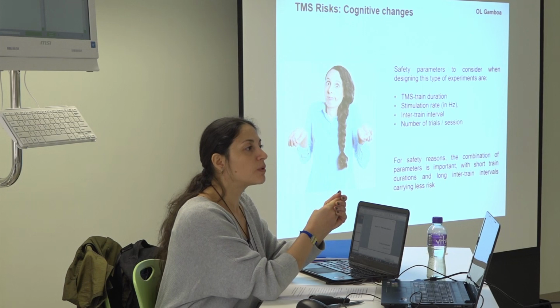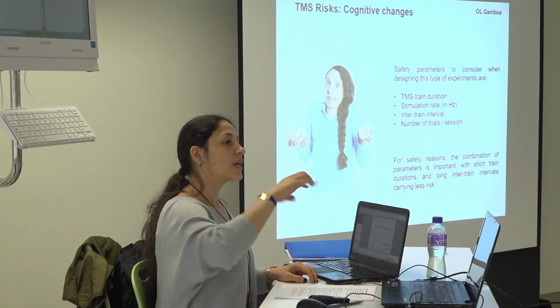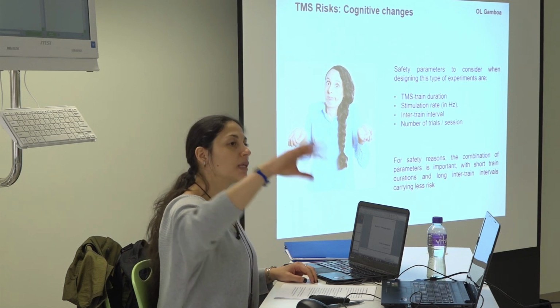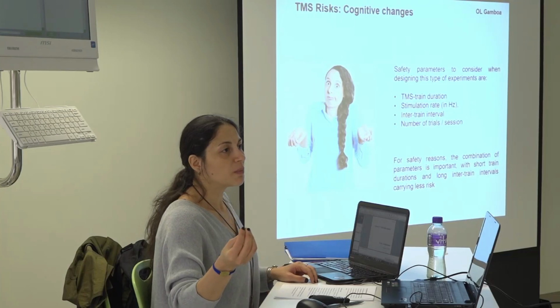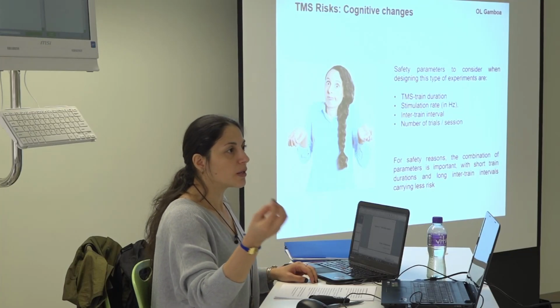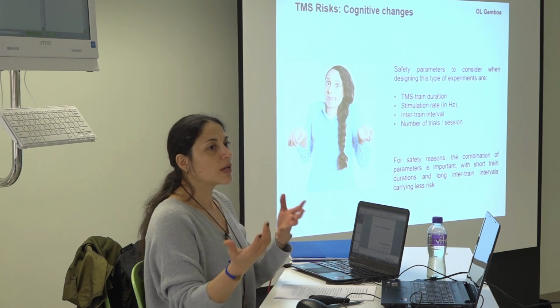When you plan an experiment, check the literature and what is possible and what is not. I cannot tell you here all the possibilities because there are many, but definitely you are not free to do anything you want. You need to follow some guidelines. In therapy you use daily stimulation, but that is for therapy, right? For research, I don't know if it is that responsible to bring people every day to stimulate them for 1 or 2 hours. You need to think about it as well. We have a responsibility to the persons we are working with, and the idea is to do science to get knowledge and not to affect people, because we don't know anyway.